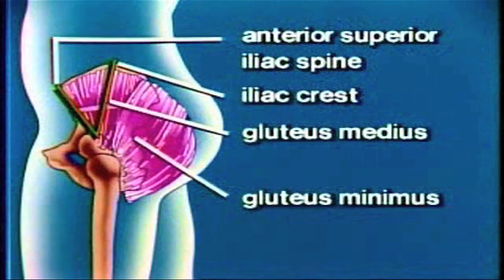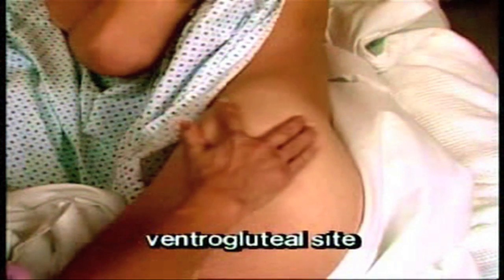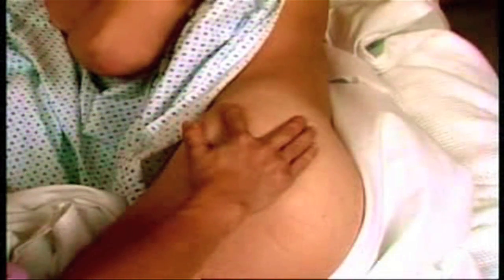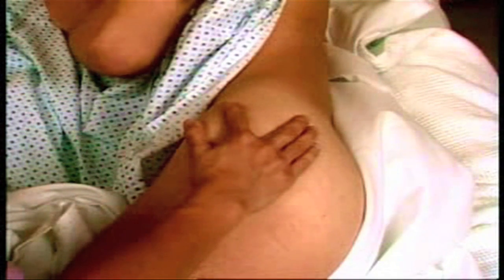The ventral gluteal site lies in the V between the anterior superior iliac spine and the iliac crest. The needle is passed through the gluteus medius muscle and into the gluteus minimus, which lies beneath it. To find the ventral gluteal site, place the palm of your hand over the greater trochanter of the femur while the patient lies on his side or back. When the middle finger touches the iliac crest and the index finger is placed on the anterior superior iliac spine, the injection site is within the V formed by the 2 fingers. This site may be used for all patients.